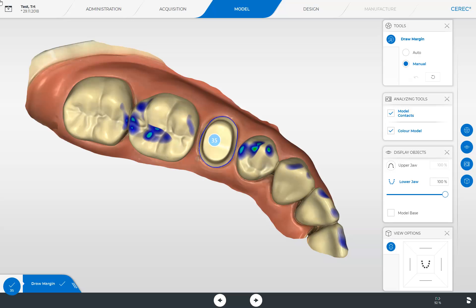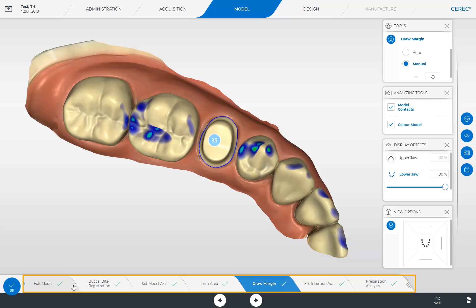Next we expand our Step menu to the full view. By tapping the two parallel lines at the end of the Step menu, all steps of the model phase are displayed. Each step is marked with a green checkmark, indicating that the CEREC software has performed all steps automatically, allowing you to change directly to the design phase after a quick check of the drawn margin.